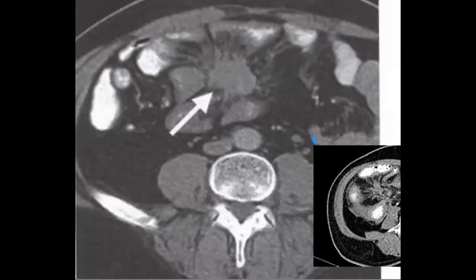There are now some nuclear scans that can add much value in the assessment, evaluation, and also the treatment, like the gallium dotatate. We are talking about the carcinoid. Yes, the MIBG or octreotide scan, and now there is a gallium dotatate scan, which is more recently accepted. So this is the typical feature of carcinoid. As you know, there is a carcinoid and there is a carcinoid syndrome.